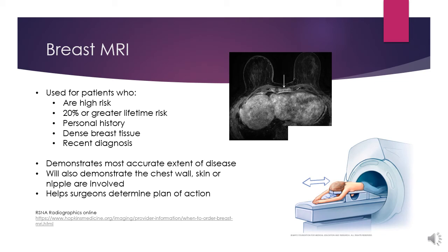The MRI can also see the chest wall a little better and see if there's any spread of the disease. It can check the skin and also whether the nipple is involved.